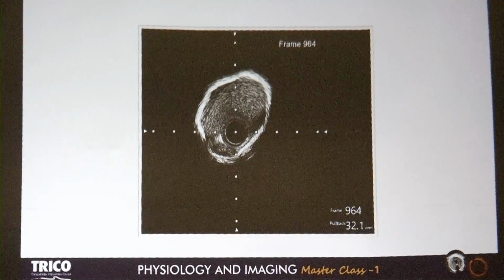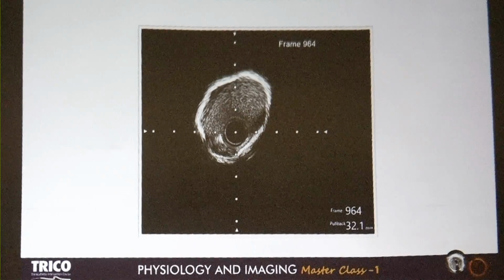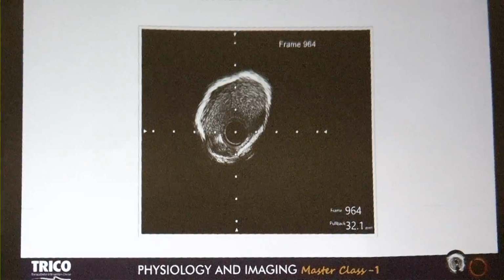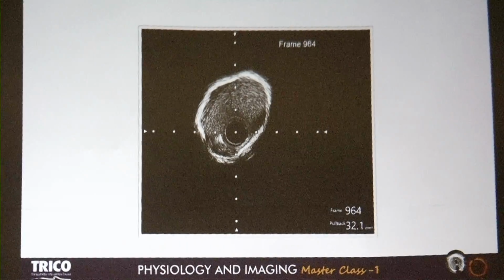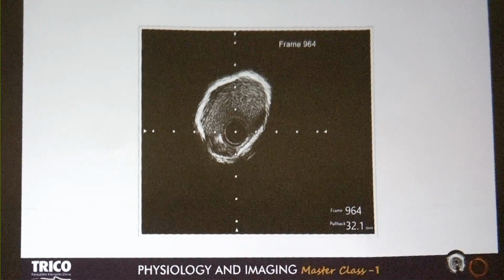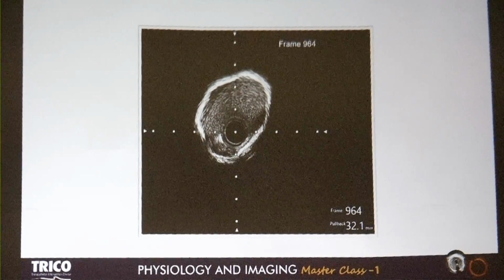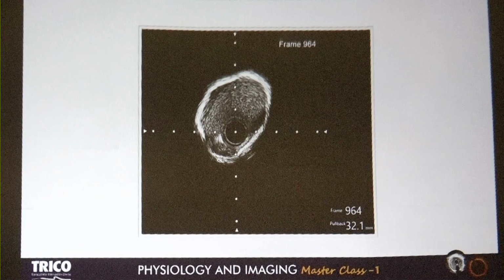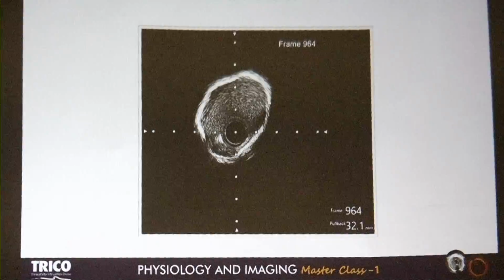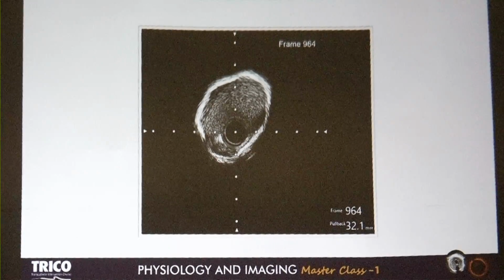Fluoroscopically, the sensitivity of detecting calcium is very limited, so there is a very high chance that imaging will show very heavy calcium. Imaging has a sensitivity of say 95%. Here the imaging could very well demonstrate a 360-degree arc of calcification across the mid-RCA, which of course was not so evident in the fluoroscopy.